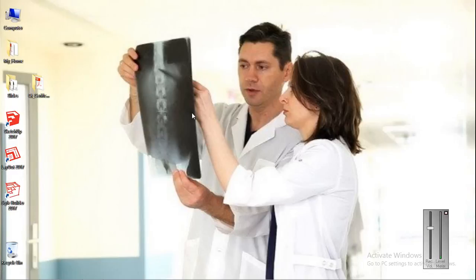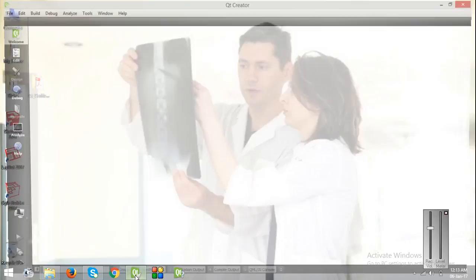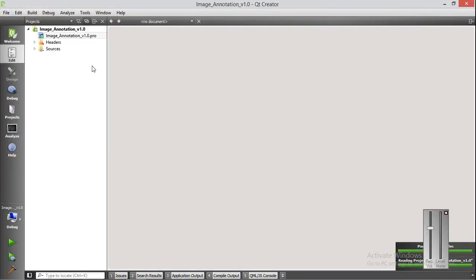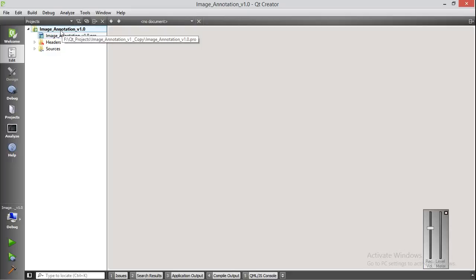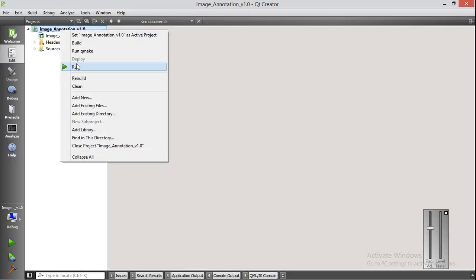We have developed an image annotation tool. Let me launch it. I am opening Qt Creator and running our image annotation tool.